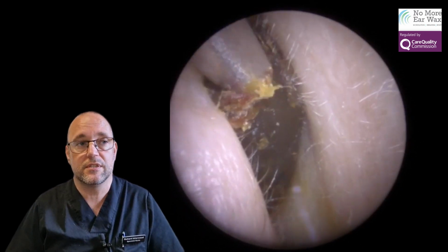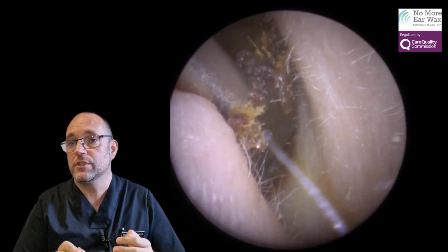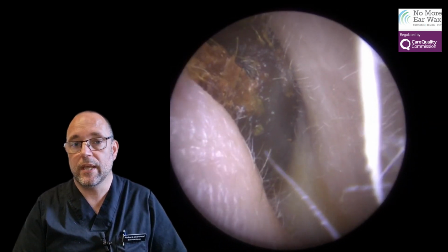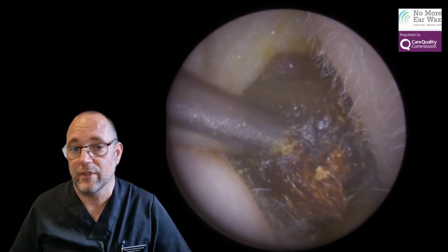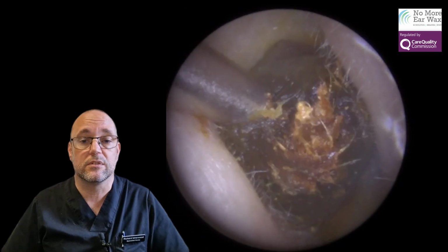You know, something that's really sloppy and wet, or particularly deep down, sometimes we just irrigate it to bring it a bit nearer, so then we can suction it out to get something off the eardrum rather than going near the eardrum with these tools, which is fine. I'm more than happy to do that, and I've done that quite a lot. But yeah, there is a time and place for irrigation. I do it quite a lot.